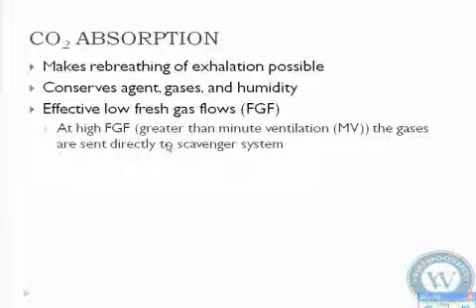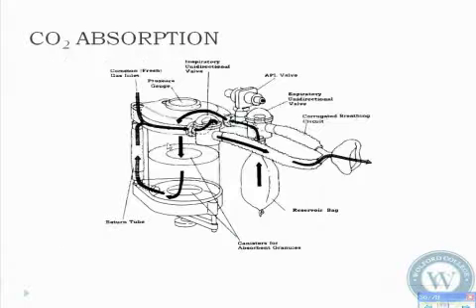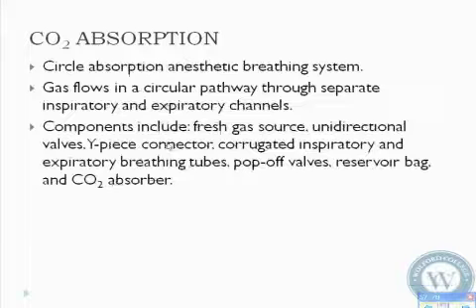If it's greater than that, at high gas flows, where do your gases go? They're all sucked out the scavenging system. You're going to suck everything out at that point. So you don't even give it a chance to go through the CO2 absorber to cause that chemical reaction to absorb the CO2. So it's only going to work at low fresh gas flows. I'll explain this further on the real pictures.